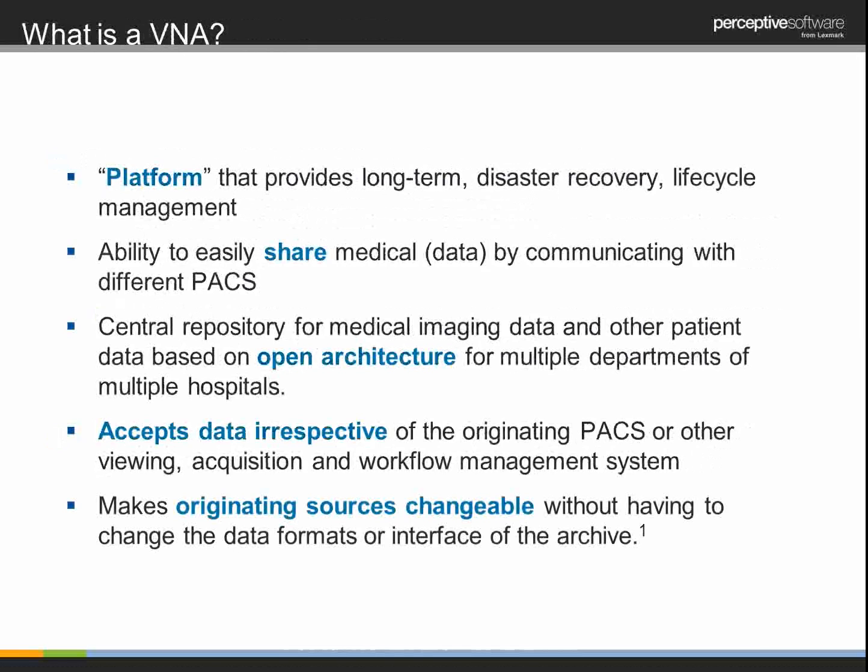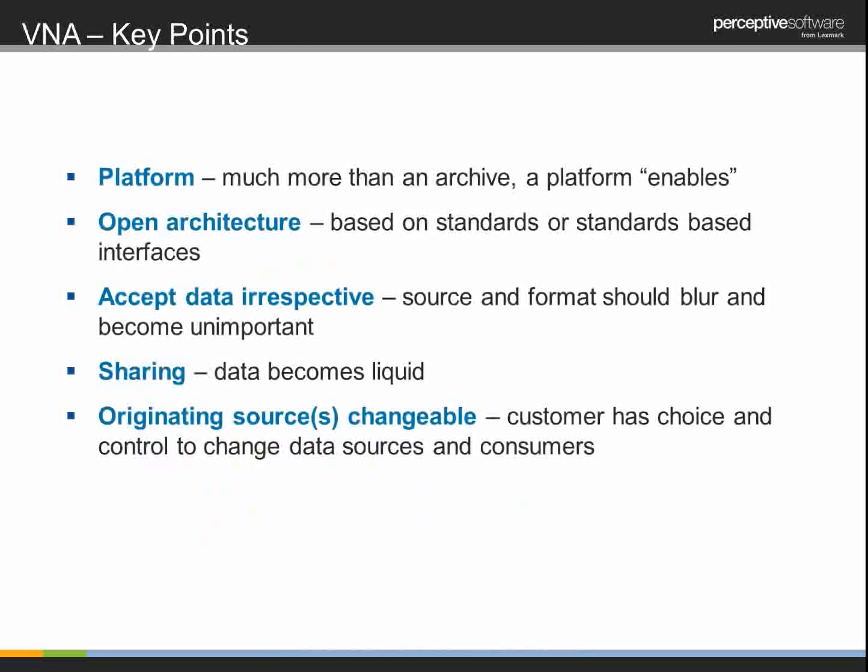I've highlighted a number of key terms here, which I think are very important in looking at what the VNA is. A platform for clinical, an enabler, perhaps, an enabler for orchestrating image movement within an institution. So it's really much more than an archive or a final resting place for clinical content.